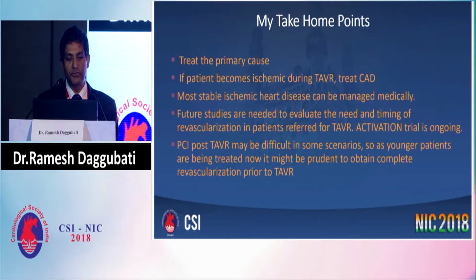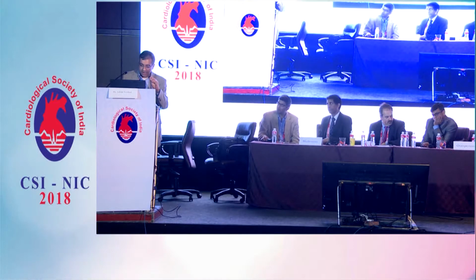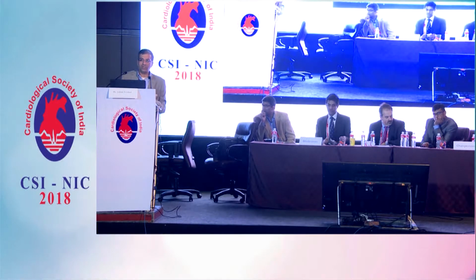As I said, we are treating younger patients nowadays, and so we have to be cautious and have a plan how to access these coronary arteries in the future if the patient develops CAD.